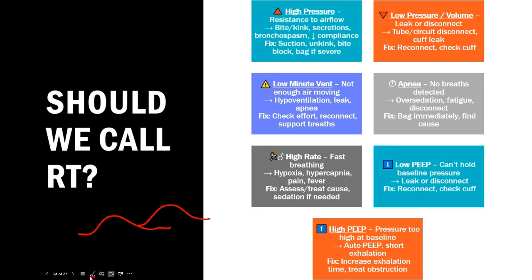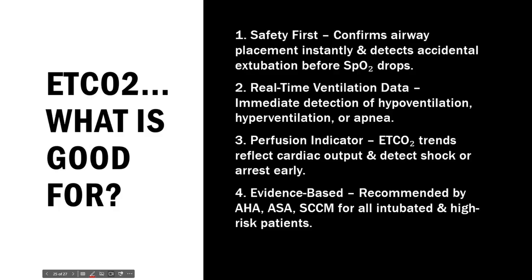So definitely want to watch for that. The quickest fix for auto PEEP is to disconnect your patient from the ventilator and compress their chest down to expel all of that excess air inside of their lungs.